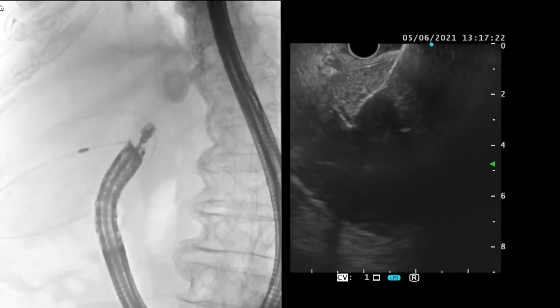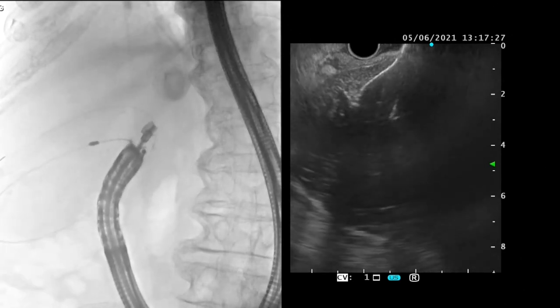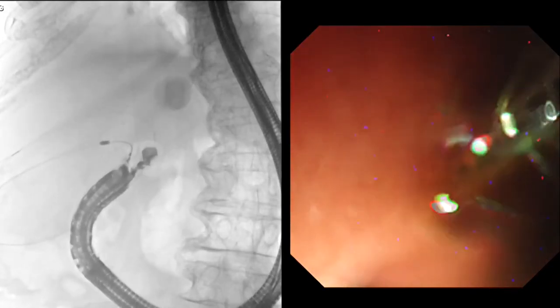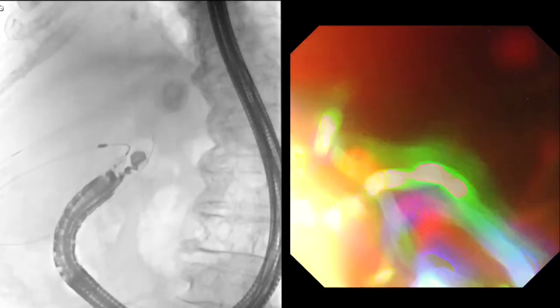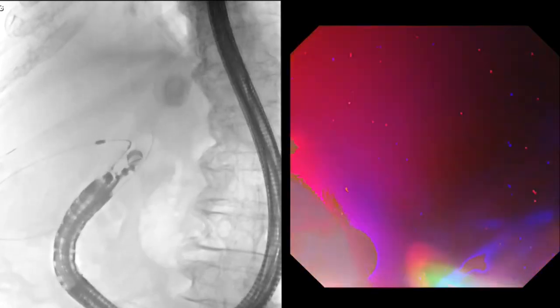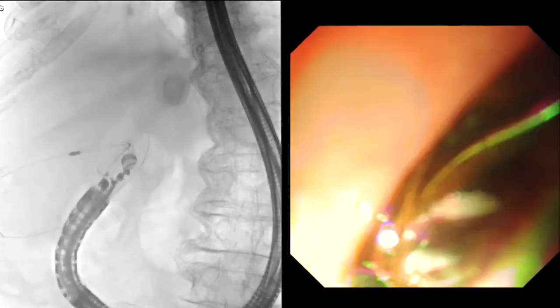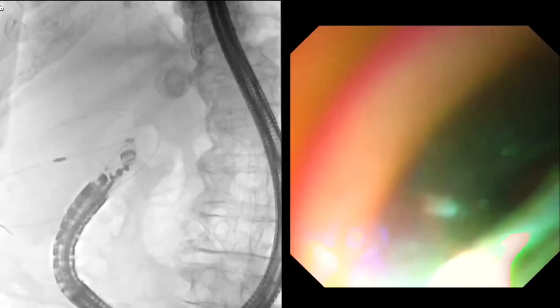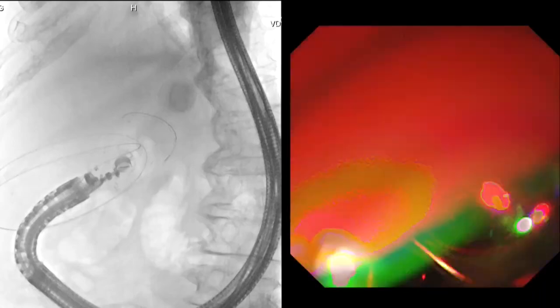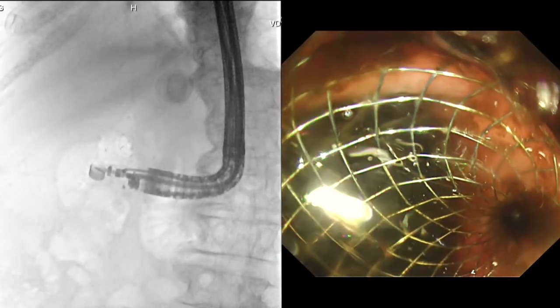In general I prefer to place the stent in the duodenum because we see much less problems of food entering into the stent and into the gallbladder, and also we don't see any buried stent syndrome. After the stent was completely deployed, I usually don't dilate the stent. You can see some very turbid bile coming out, and usually it will open up the next day. In terms of follow-up, these patients can either have long-term stenting or receive a follow-up endoscopy four weeks later for stone clearance.